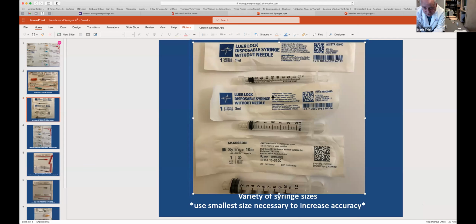How do I choose as the nurse? It depends on your dosage amount, how it's dosed. This is a very good syringe if you have 0.5 ml, right there. The 1 ml is divided into tenths of an ml. I don't have a tendency to use this particular syringe when I have to inject a full milliliter.